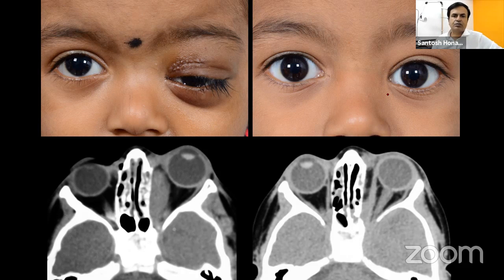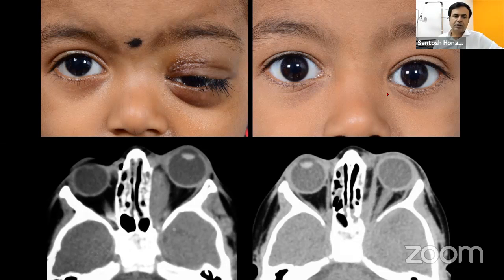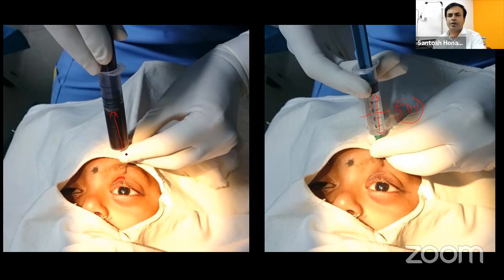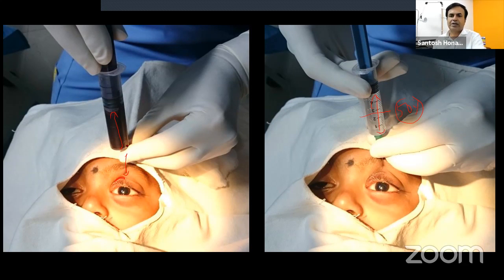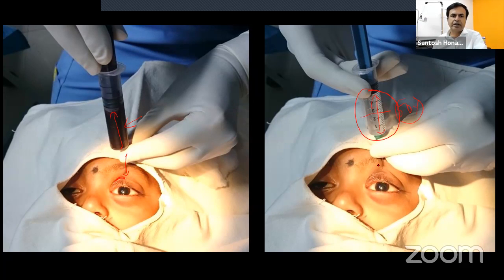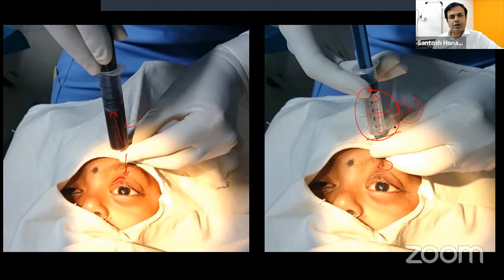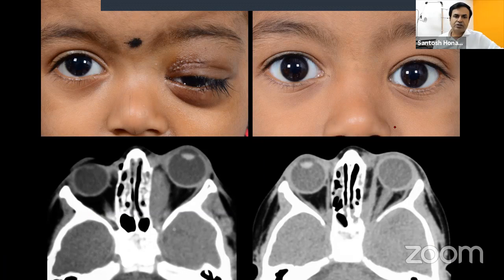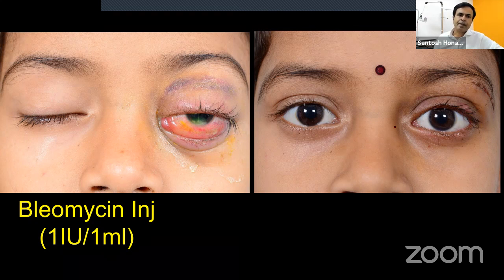After aspirating the chocolate cyst and injecting bleomycin, the patient does well. The key tip is to leave the needle right inside the macrocystic cavity without moving it, then simply switch the syringe from the one that aspirated blood to the one containing bleomycin — so you stay in the macrocystic cavity and don't inject somewhere else where the lesion may not be.